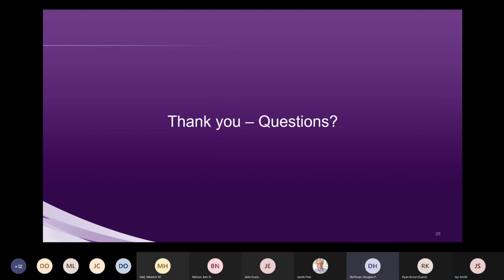Yeah. Well, I just want to echo your points about efficiency. I know in our organization, a large organization, we are slowly transforming the workup of carpal tunnel, and it's now a minority of people that are getting electrodiagnostic studies. And again, echoing Jay's point here, you can efficiently do this in 5 to 10 minutes, and also anatomically identify any lesions that might affect the choice of, let's say, a carpal tunnel release or so. So any other questions from anybody else?